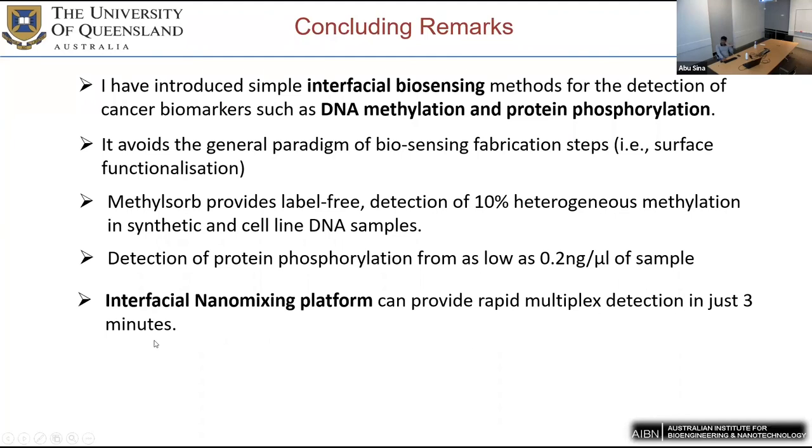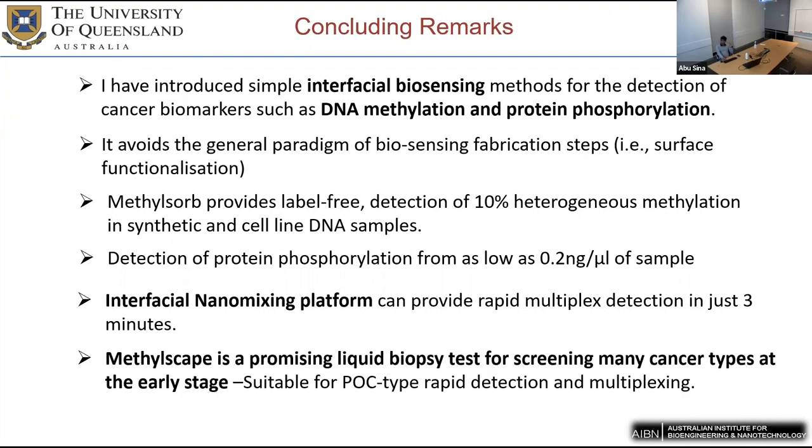The interfacial nanomixing platform can provide rapid multiplex detection in just 3 minutes, and methylscape is a promising liquid biopsy test for screening many cancer types at an early stage, suitable for POC-type rapid detection and multiplexing.